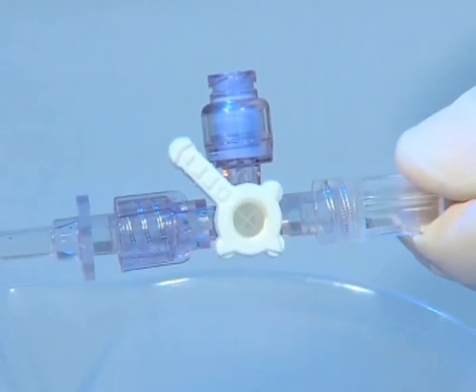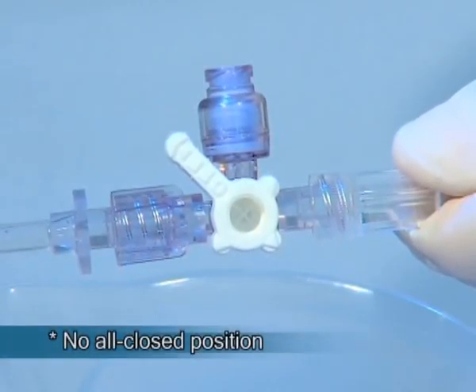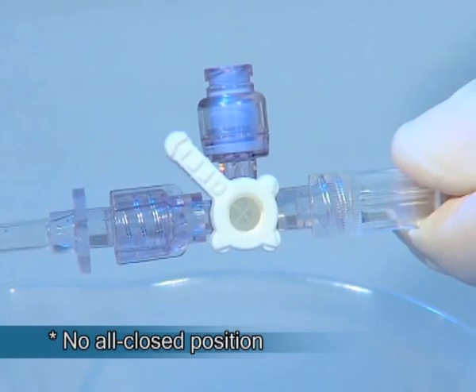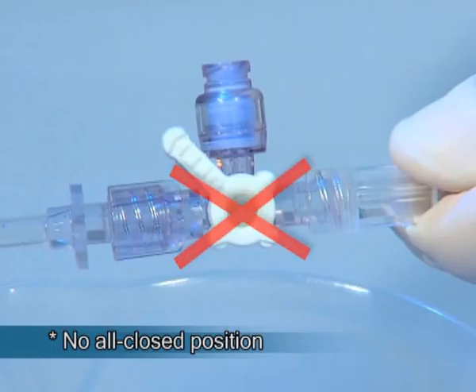The only significant change in operating the Marvelous, in comparison to a standard stopcock with a lure activated valve, is that there is no all closed position when the handle is turned to 45 degrees.